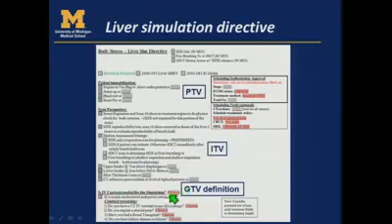And then the IV contrast is important to tell your sim therapist what time, what do you want to scan at 40 seconds, 65 seconds, 80 seconds, because that will really impact how well you visualize the tumor. So all that information would be really nice to have up front so there isn't any miscommunication at the time of sim.